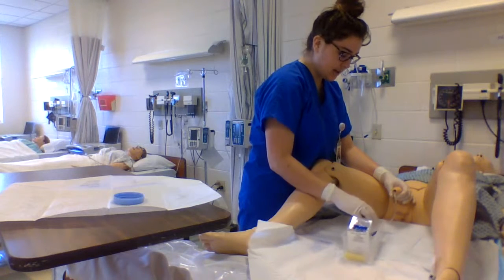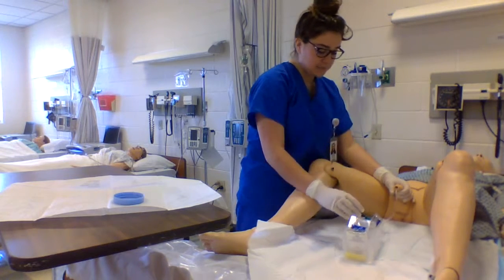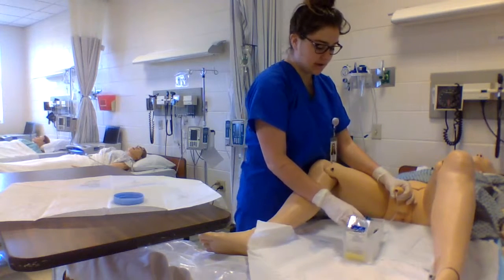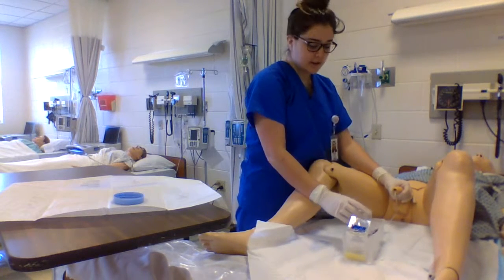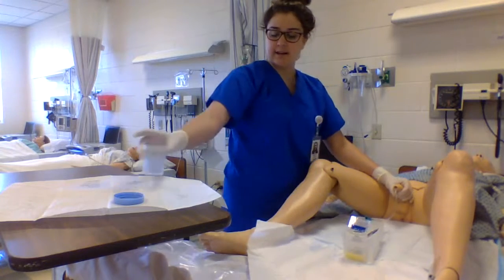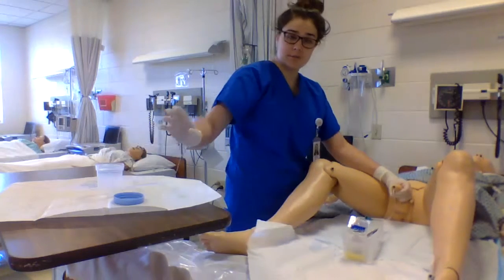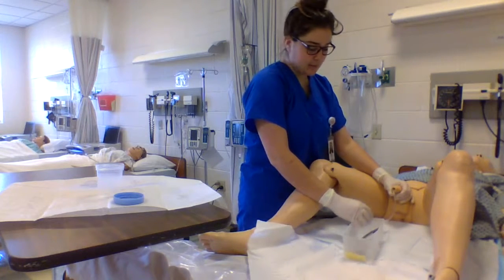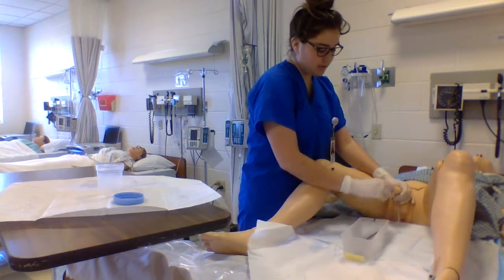And once I get urine, I'm going to go ahead and collect my sample. And once I get enough in my cup, I'm going to continue to let the urine go into this container. And while it's going, I'm going to go ahead and set it up here, which is also my sterile field. And then once it's done, I'm going to remove the catheter.